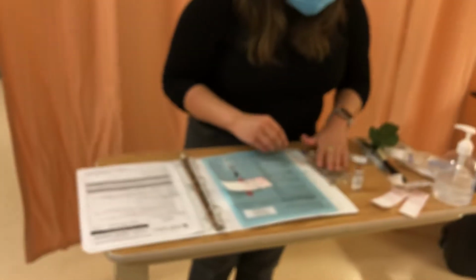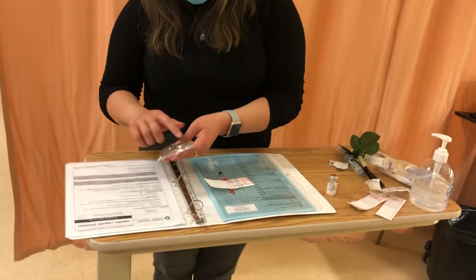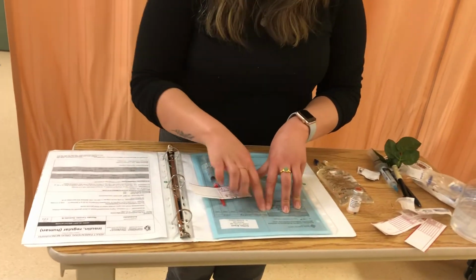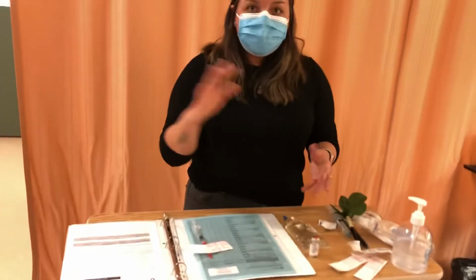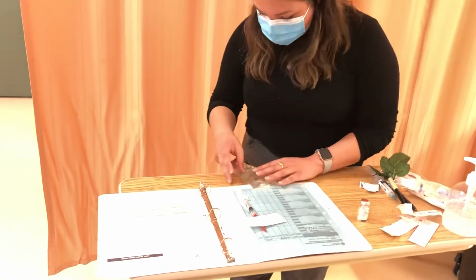Okay, and then finally, I also need to confirm that I have the correct diluent, so I have 100 mLs of normal saline. And then for the final right, date and time, it is due today, it is due now, and no one has signed for it yet, so I'm able to go ahead and continue this. At this point, I would have a second nurse come complete their independent second check. So they come, they approve, and I'm able to inject into my mini bag now.